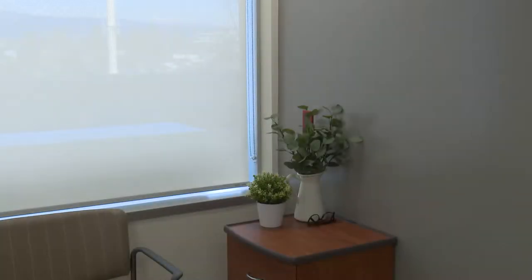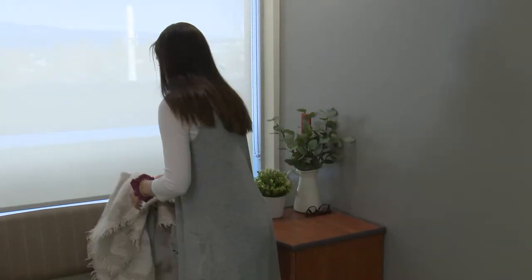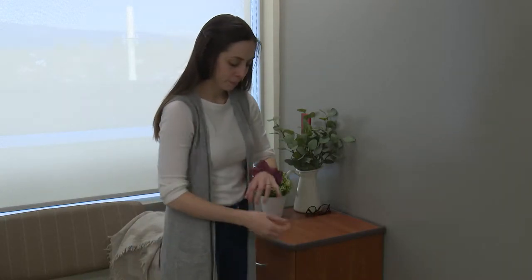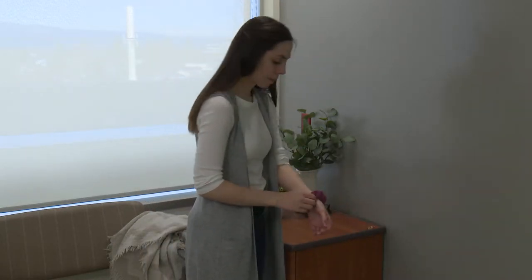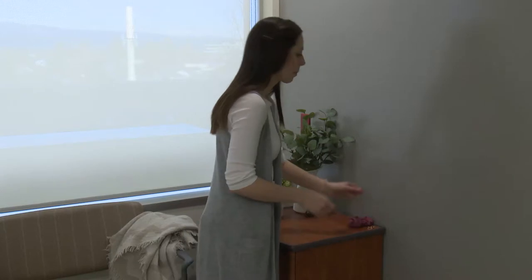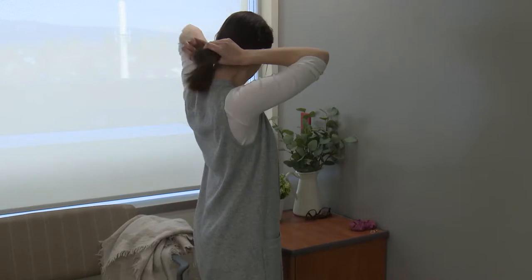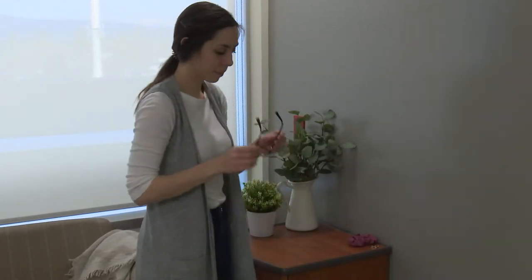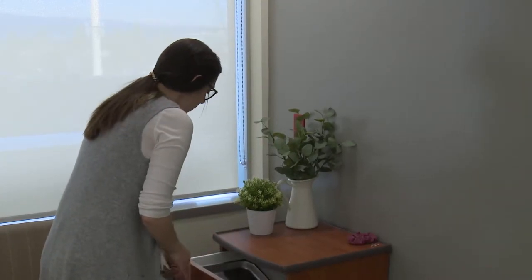To prepare yourself, make sure you remove any loose clothing or accessories that may fall onto your workspace if you bend over. This can include long necklaces, baggy clothing, or a scarf. Make sure that your sleeves are rolled up, and remove anything on your wrists and hands, such as rings, bracelets, and watches. Make sure that your hair is tied back and off your face, so it doesn't bother you or fall onto your workspace. If you need glasses or contacts, make sure you're wearing them.